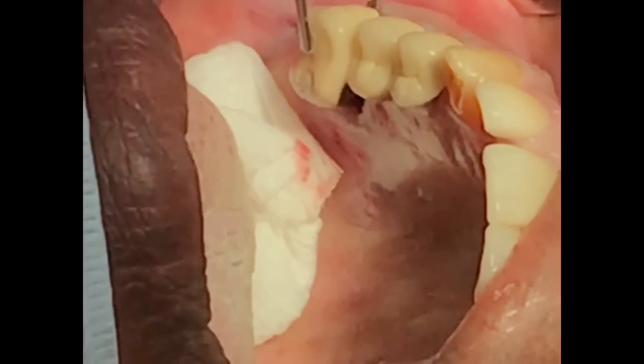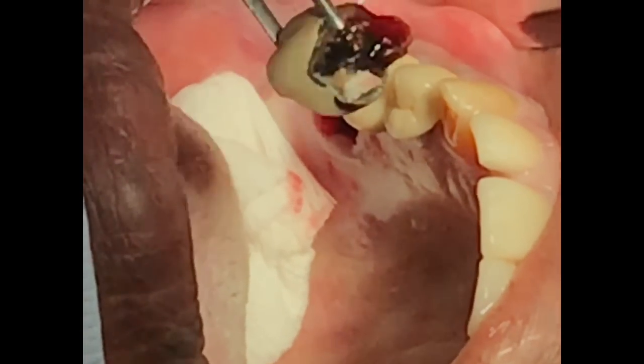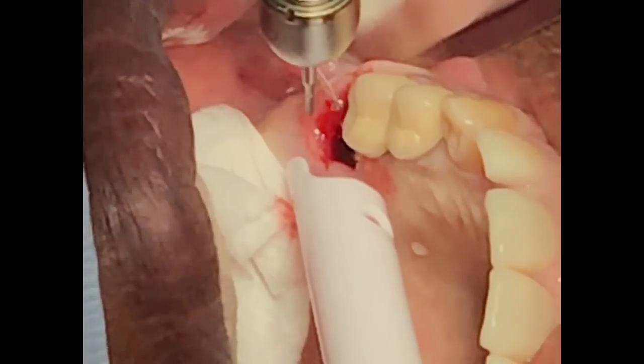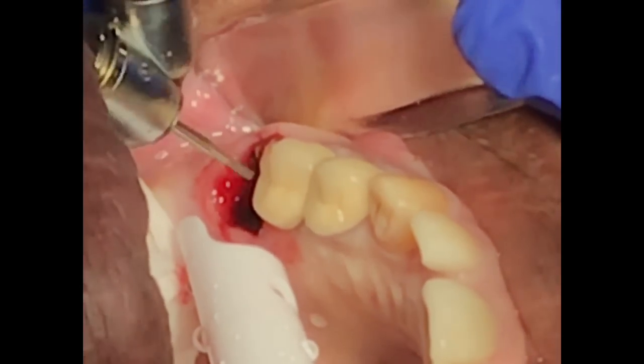In this case, the crown is ready to come out. Once you take out the crown, the only thing you have left is the root. But that root is not going to be easy to remove by any tool unless you use the surgical handpiece. I will show you how to use the surgical handpiece to cut this tooth in 3 or 4 pieces.